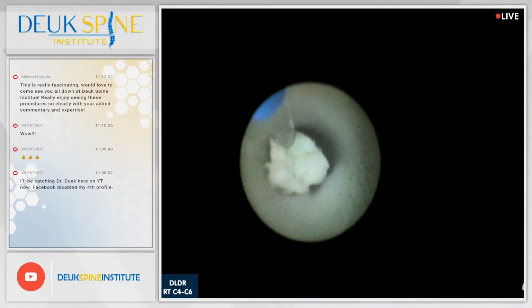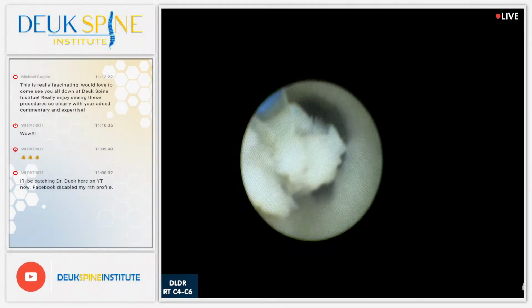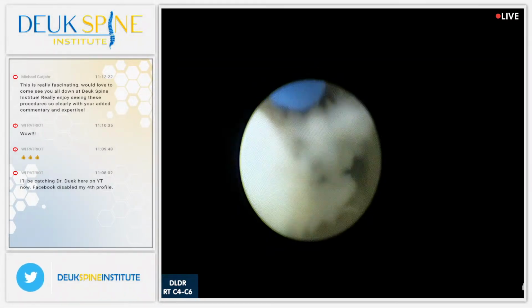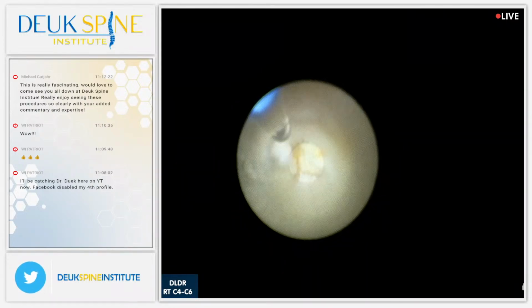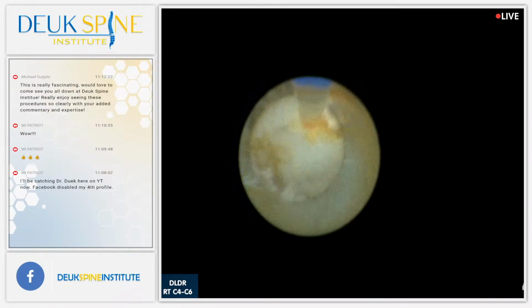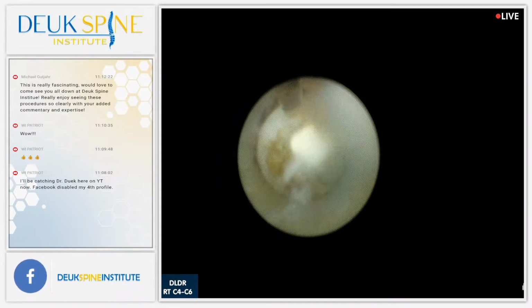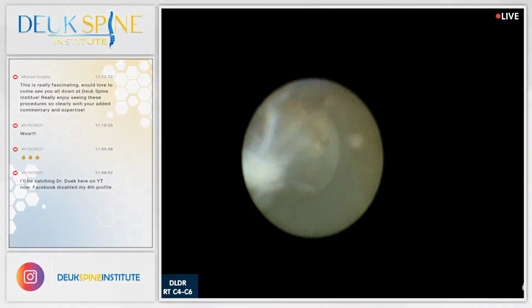And my foot is getting wet. Before the legalization of cannabis, this is coming out nicely. Look at that. Boom. Come on. Get out of here. All right, we're going to say it together. Get out of here, you bum, to the next piece of herniation that we float out. Okay, you guys say it with me. Get out of here, you bum.